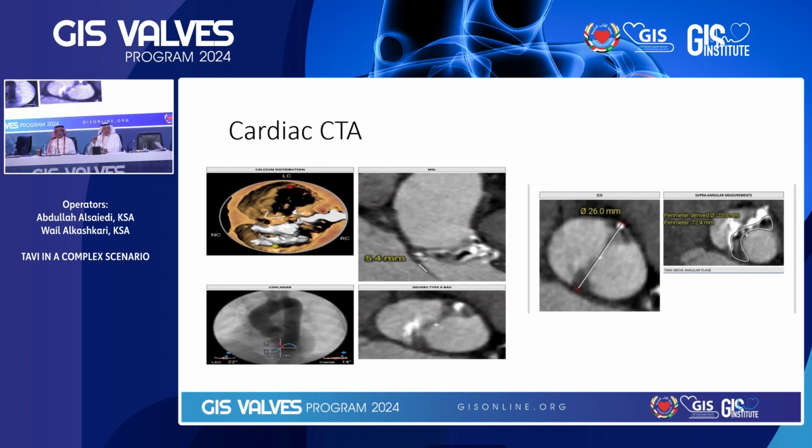Okay. So we're going to fix the coronary before, Dr. Muhammad, or we go with the valve first? No, of course, I will fix the coronary. It's the presentation. She came with non-STEMI. I will not entertain the TAVI now. I will go for the coronary, fix the coronary, and then I don't have to do it at the same session. Let her settle down, and I will plan her to fix the aortic valve. So that is the message. If there is acute coronary syndrome, you should go for the coronary first, and then if heart failure, you go for heart failure.